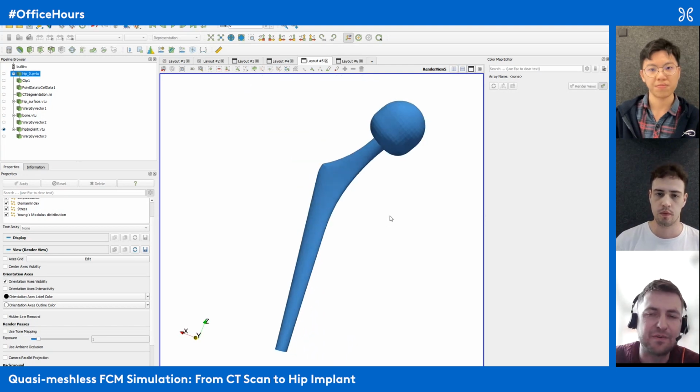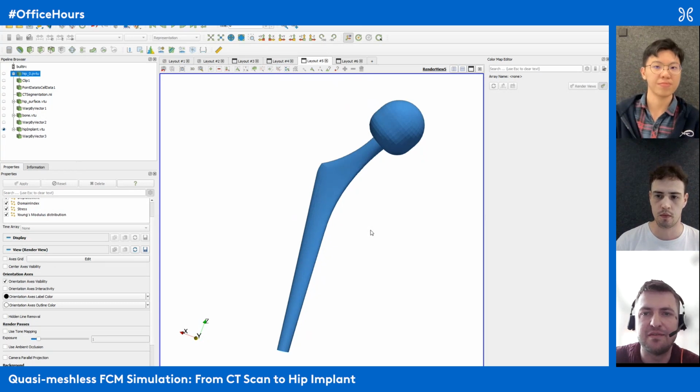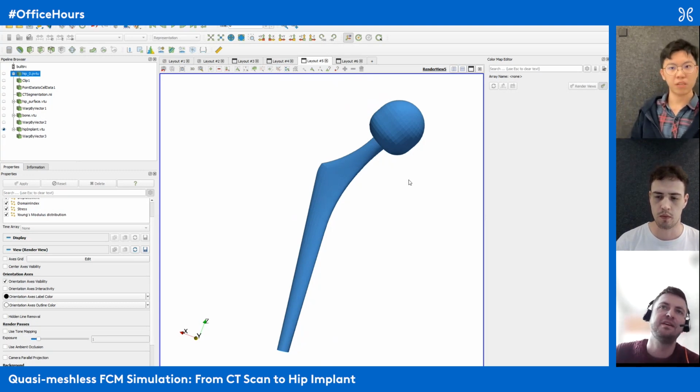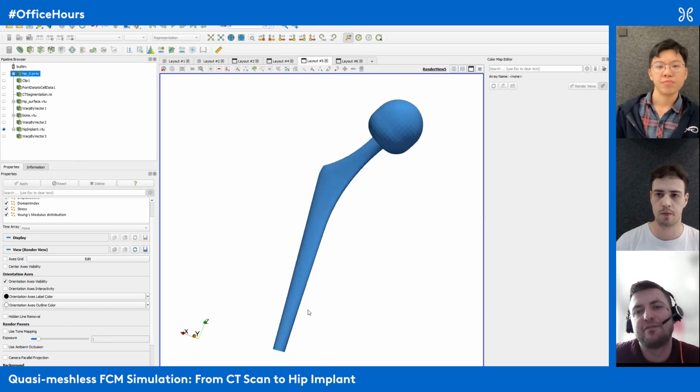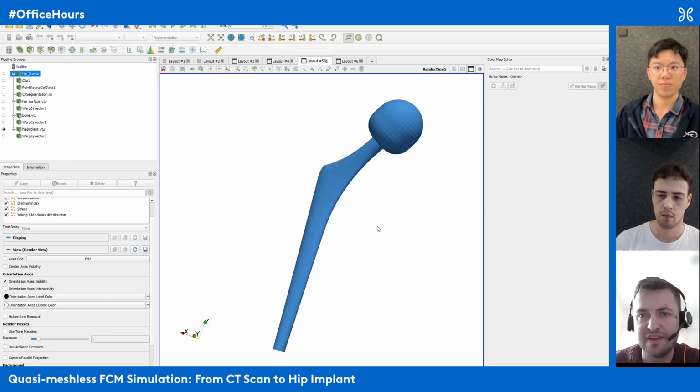The thing here is that it is really true that one size doesn't fit all. There are short people, tall people, men, women, different bone structures, different ages. Probably a family of implants will not be perfect for everyone. So probably you don't want one implant for every patient, unless you go for something based on additive manufacturing, right? Because additive manufacturing is actually pretty good for this.